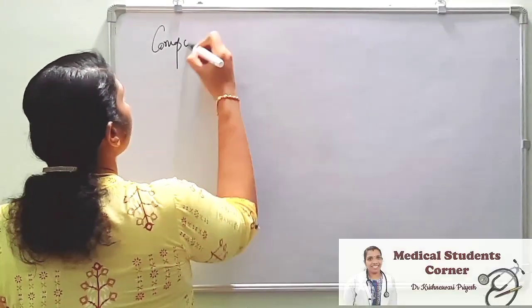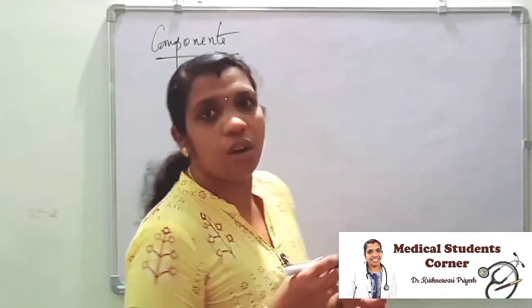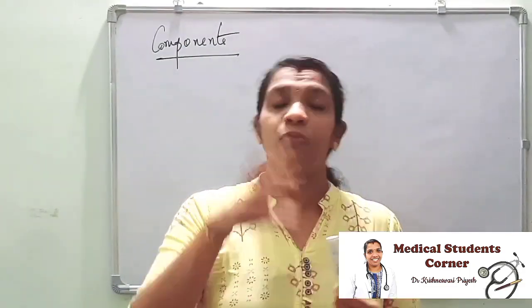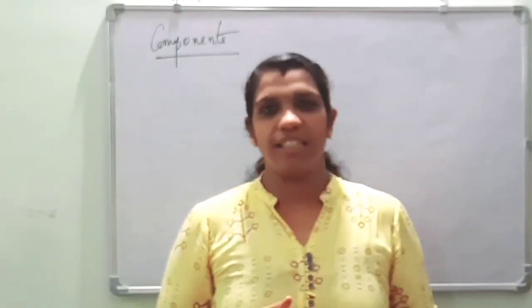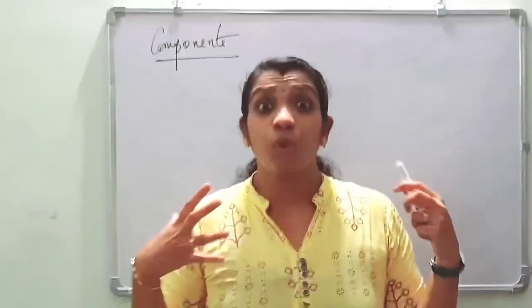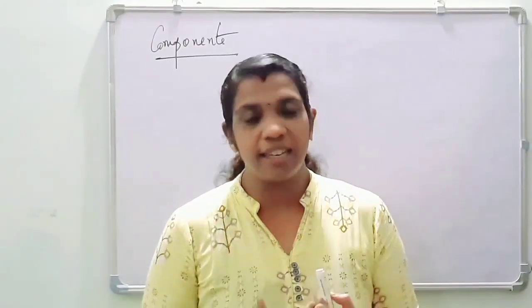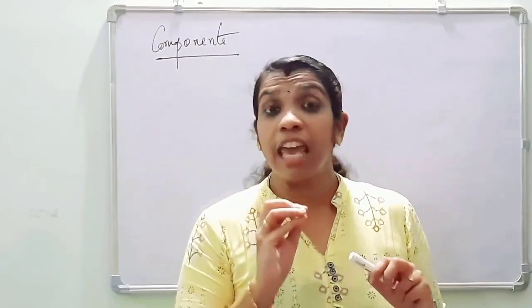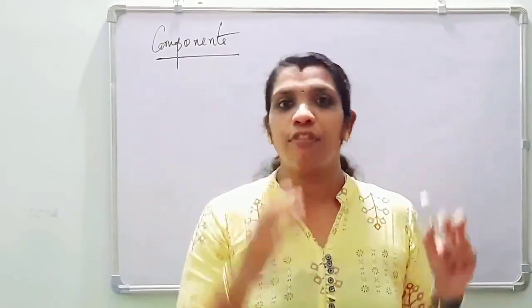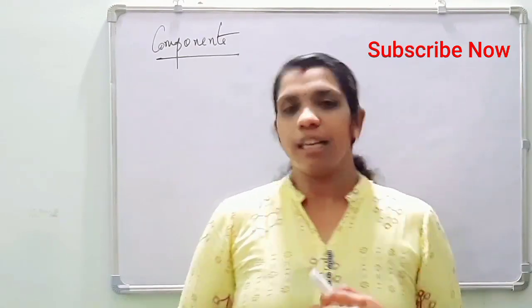So we all know that ECG is a complex, is it not? It is not a single thing, it is a complex. That is, there are so many things which form an ECG. So in ECG there are so many waves, segments, and intervals. So today we are focusing on the waves of ECG, the various deflections in ECG.